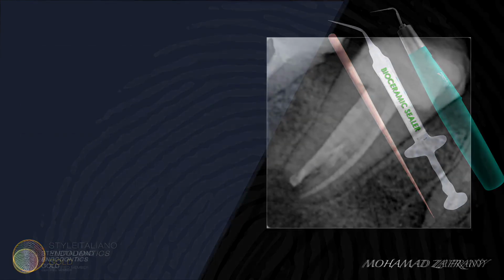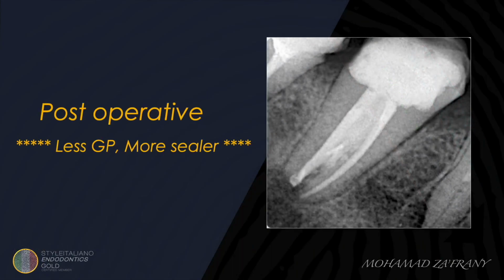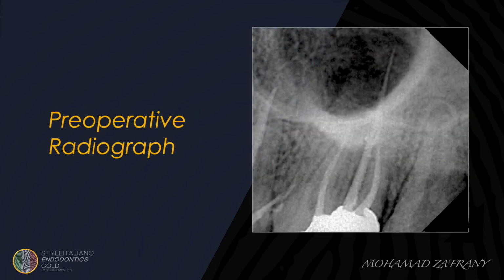Now you can see filled main canals, and the isthmus is also filled, thanks to the passive hydraulic condensation using bioceramic sealer. This is what we are calling 3D cleaning and 3D obturation. Another case of retreatment of a maxillary second molar.